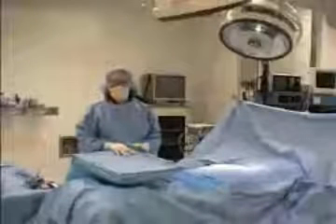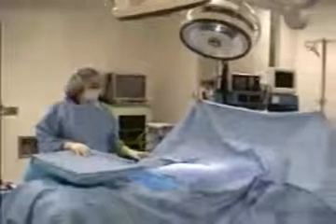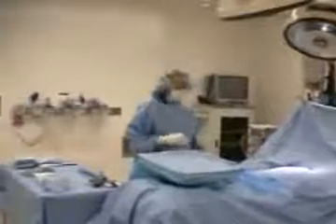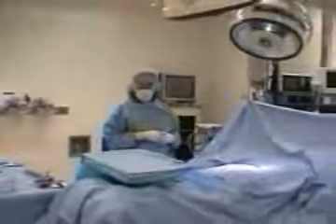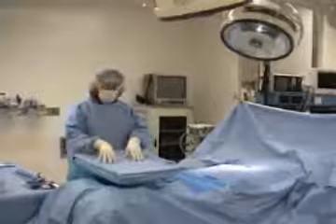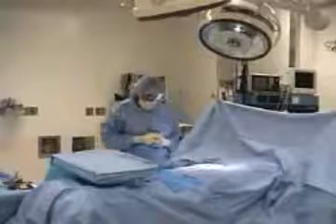Once the sterile field has been established over the patient — in other words, the drapes have been placed — in this case the patient is draped for an exploratory laparotomy, notice there's an opening here for that. Once the patient is all set and the furniture is where it needs to be, you would come forward and ask the attending or the resident where would be the best place to stand. The scrub person stands behind the mayo stand, so it's very important that you don't lean on this working table. Approach the field wherever you're asked to be, keep your hands folded on your stomach or right under your nipple line, and stay put.